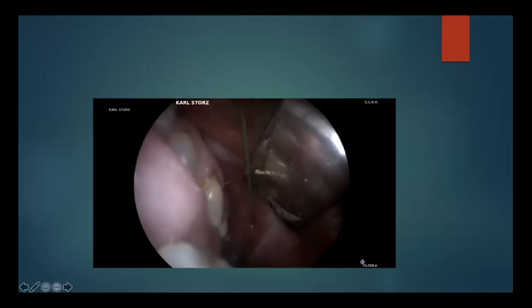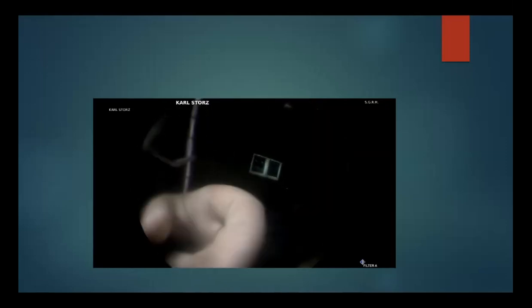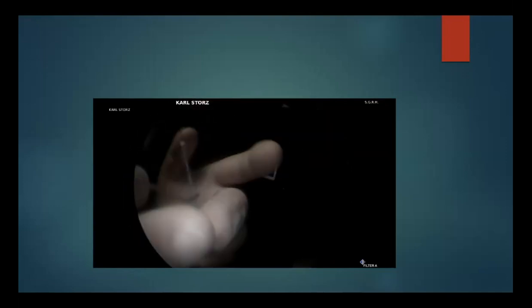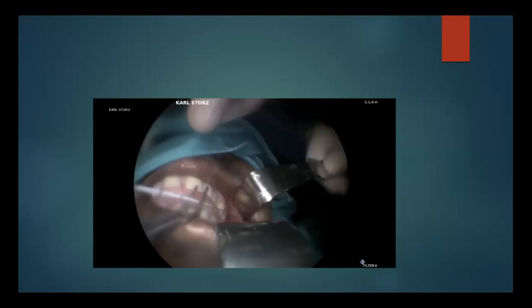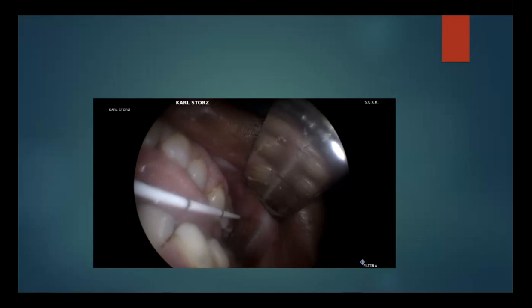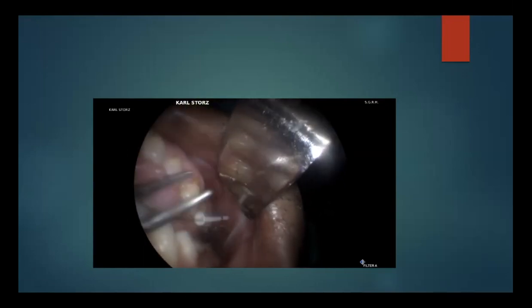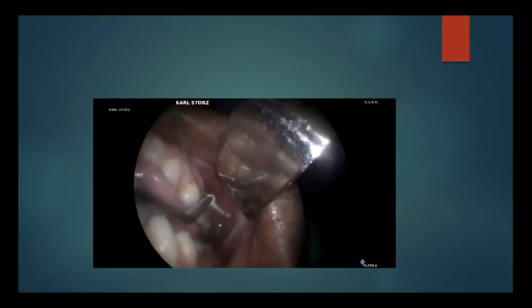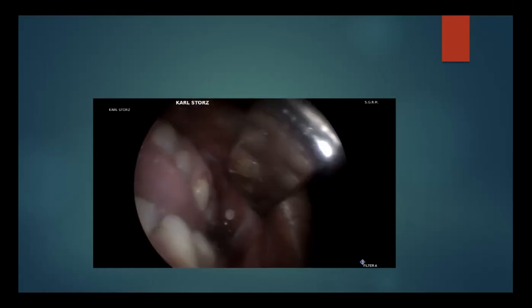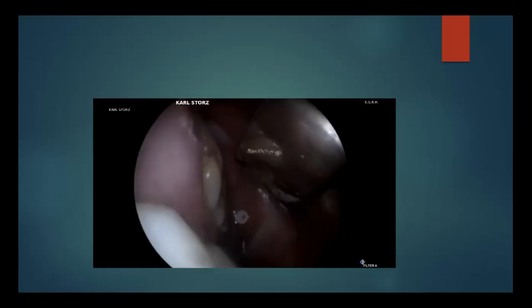So what we do, we have those pre-made stents where a company is quite happy to make it. We load it onto a guide wire, and it's really just slid inside. You can see it sliding over the guide wire, and it goes through the papilla, right? And you basically just slide it across, and it goes and sits inside the duct. You see the end of the stent has a flange with multiple holes within it, where you can just use a non-absorbable suture and stitch it to the buccal mucosa for it to stay in place. So that's the stent.